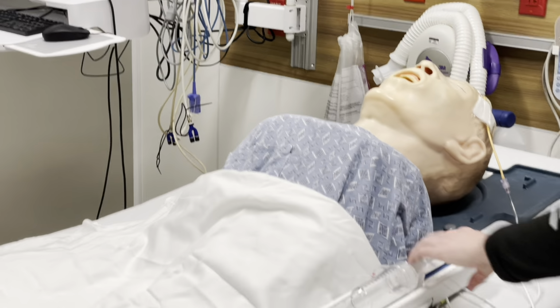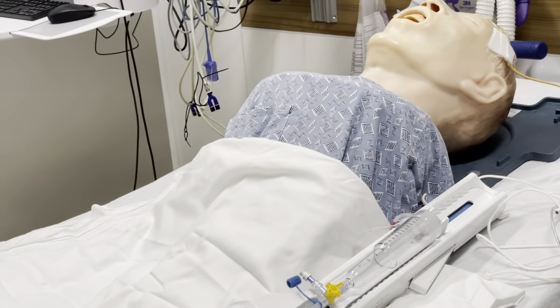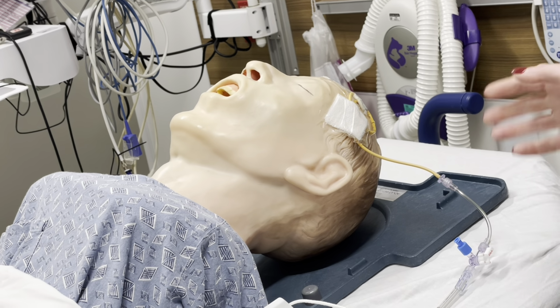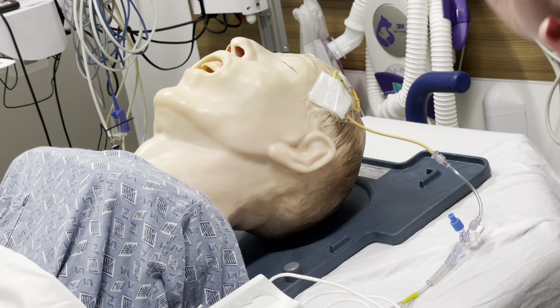You're also going to take a look at your site, make sure that nothing's coming up and that you don't have any crazy bleeding, swelling, anything around this area that you would need to be contacting neurosurgery for. So once you get your drain and you know that all of your stopcocks are off, you're going to go over to the computer, look at your order sets, and figure out what your physician orders are and what type of drain you're dealing with.